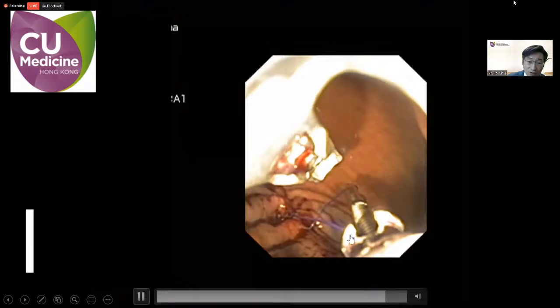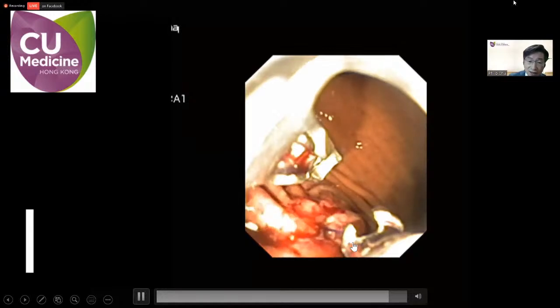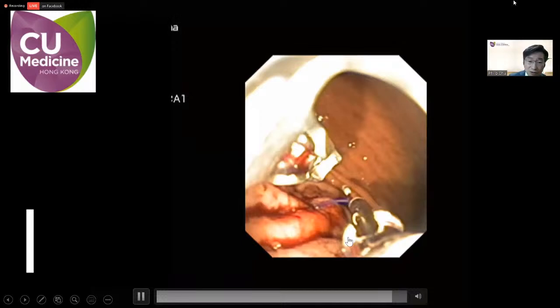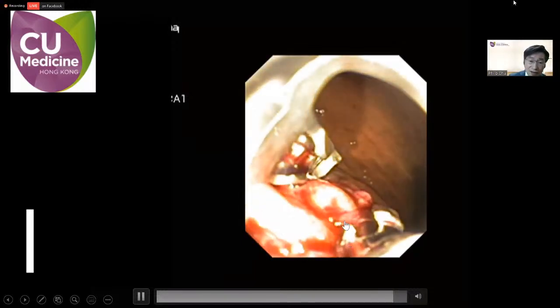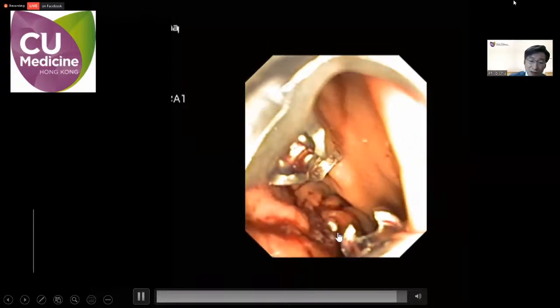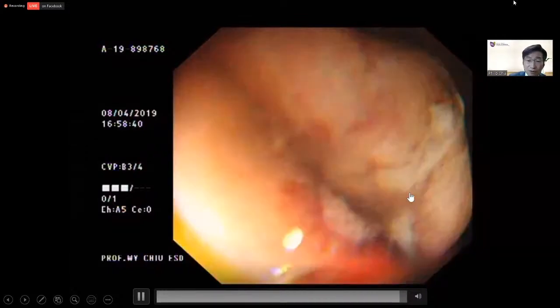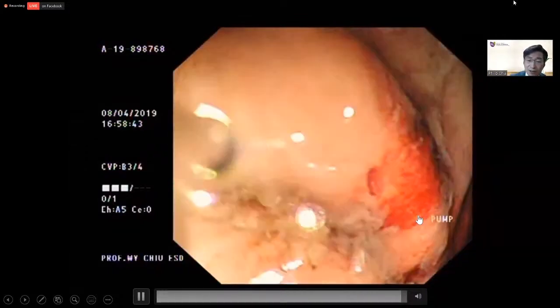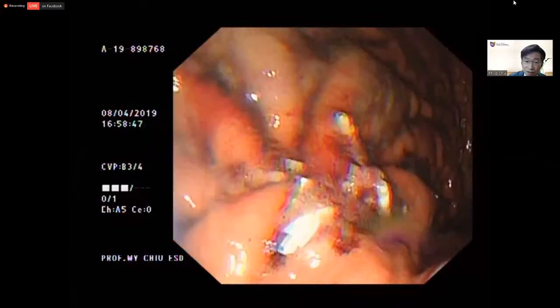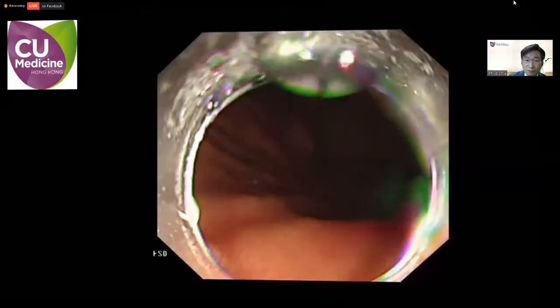So now I just drop the needle, which acts as one of the ends to pull the needle, while afterwards I will use a cinching device and tighten the suture. I usually apply it in a figure of 8 manner for closure, and also I would perform 2 sutures, not only 1, because of the safety issue. After the completion of the suturing, you can see a very definite closure and a good capsule.